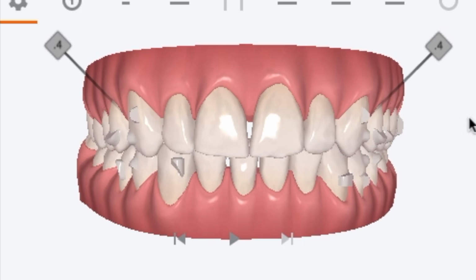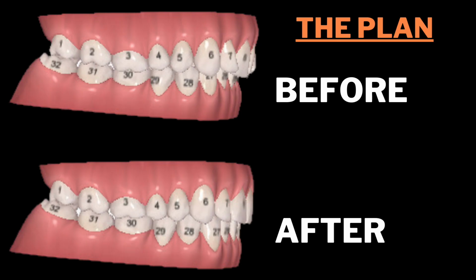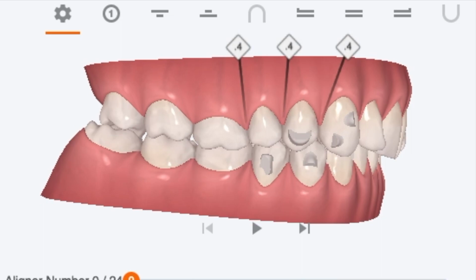Now let's take the side view. From the picture and the beginning of the video, you can see that I've got a bit of an overbite. You can see those teeth kind of twisting and then the front teeth pitching backward. I still don't think the picture shows a really dramatic change.